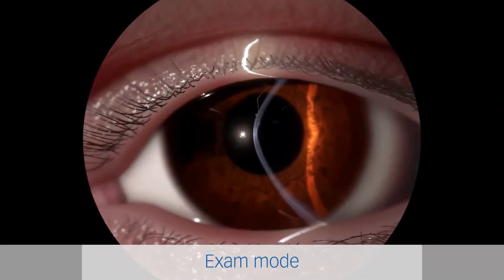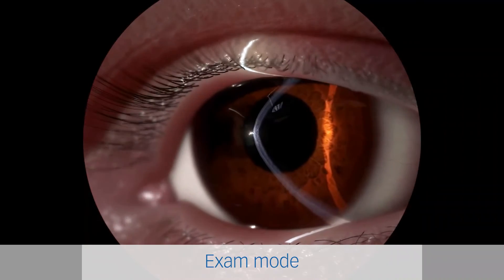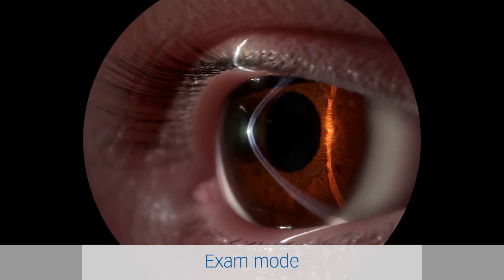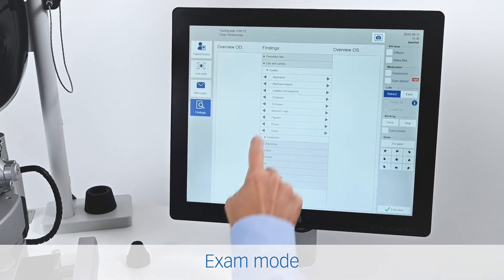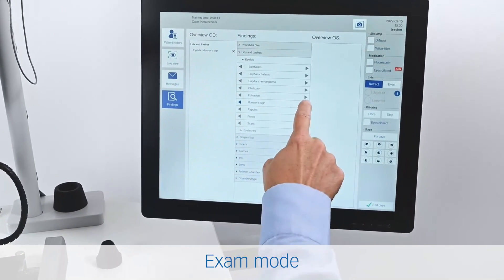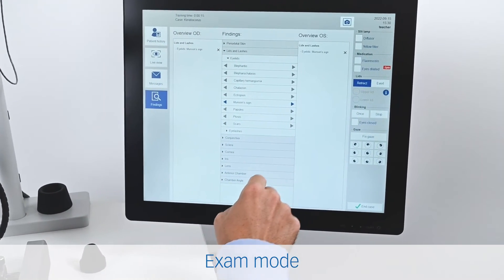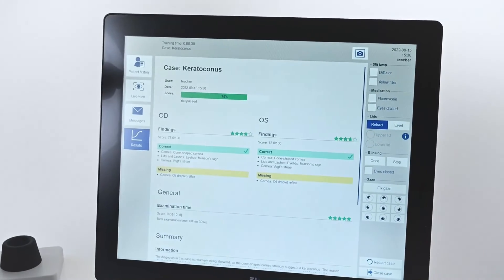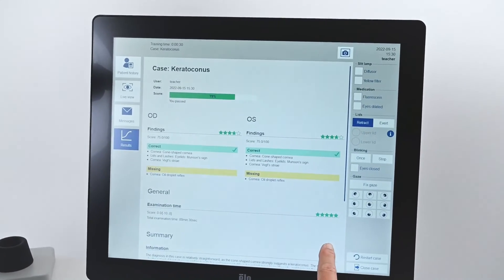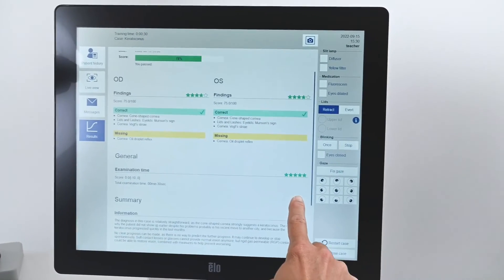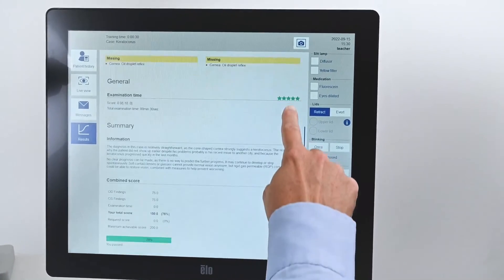In exam mode, trainees do not get any support but need to specify their findings and diagnosis using multiple choice forms. Trainees receive immediate feedback on their performance after each examination.